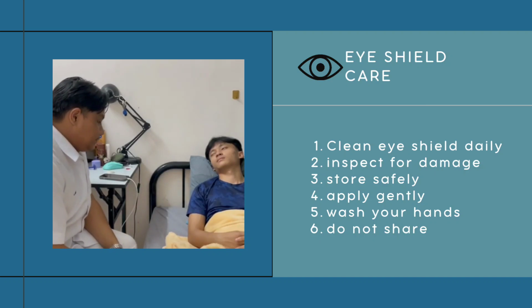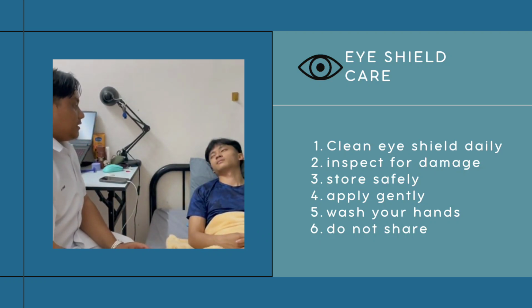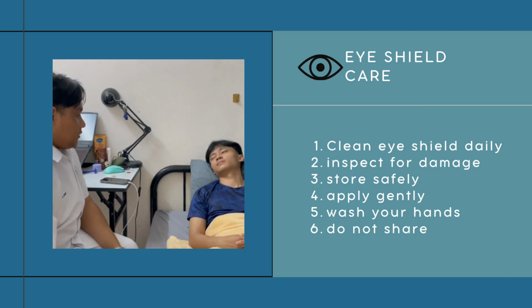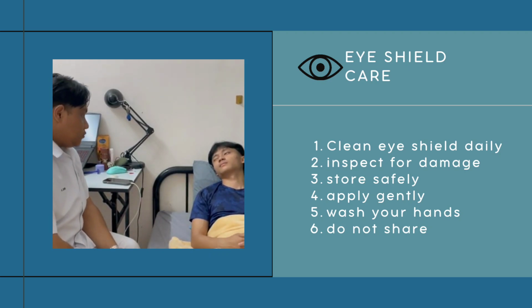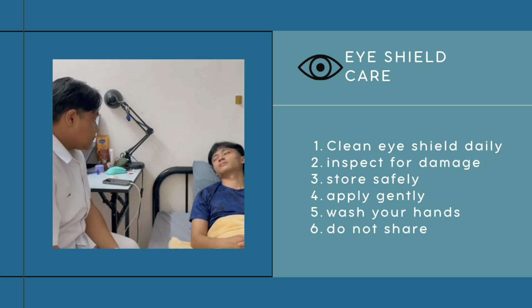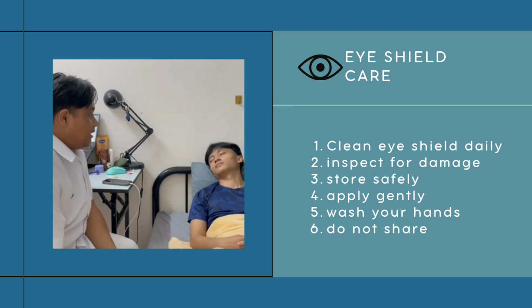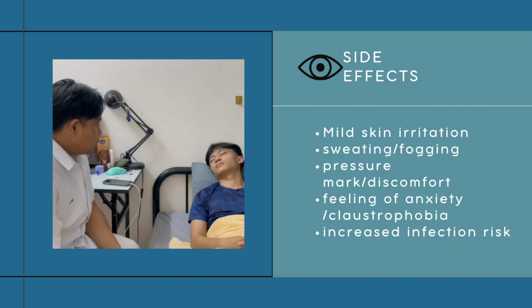Right. Next, you will need to store it in a dry and clean place, in a container, for example. And then, if you want to use the eye shield, you need to wash your hands first to prevent any infection. Last but not least, the eye shield is for personal use and you cannot share it with other patients or other people.